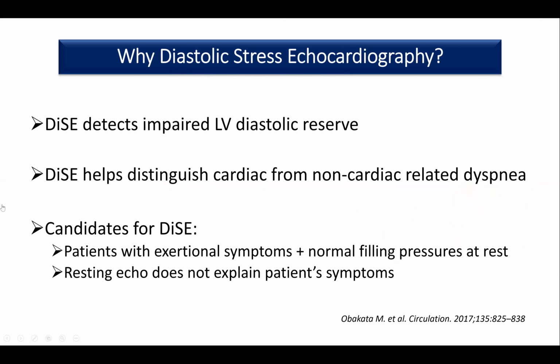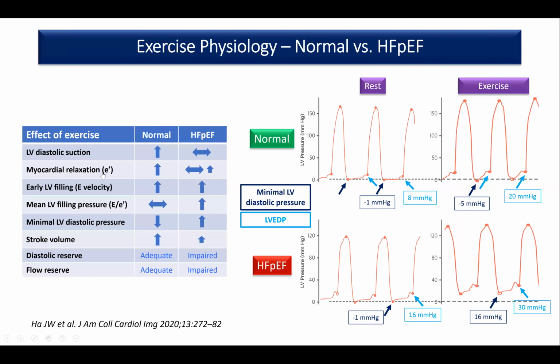Who are the candidates for diastolic stress echo? This patient I just showed you, patients who have exertional symptoms and normal filling pressures at rest. And particularly patients whose resting echo does not explain the patient's symptom, which is mainly dyspnea on exertion. Okay, so let's look quickly at what exercise does to normal physiology. What does it do to a patient with HFpEF?